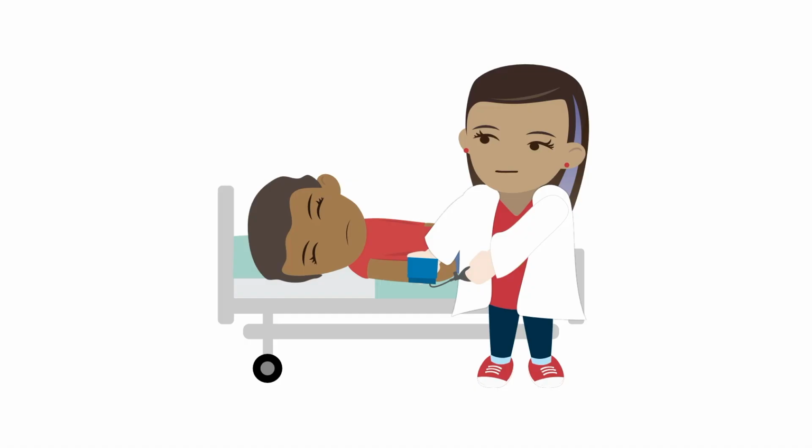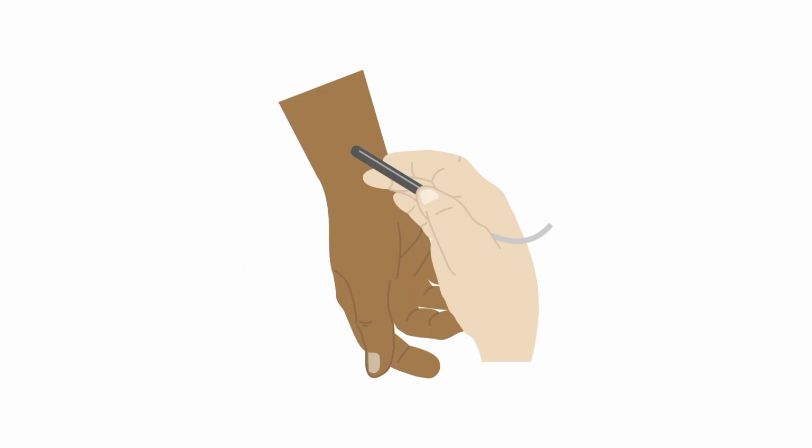With the patient lying supine, apply the cuff or cuffs to the limbs, starting with the brachial artery in the right arm. Hold the Doppler pen as though it is a real pen. The strongest signal is at an angle 45 degrees to the artery pointing toward the heart. Use this technique. Find the right radial artery at the thumb side of the inner wrist.